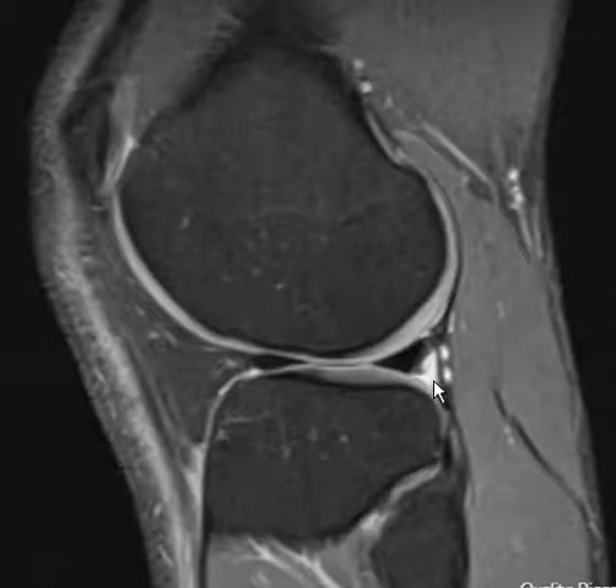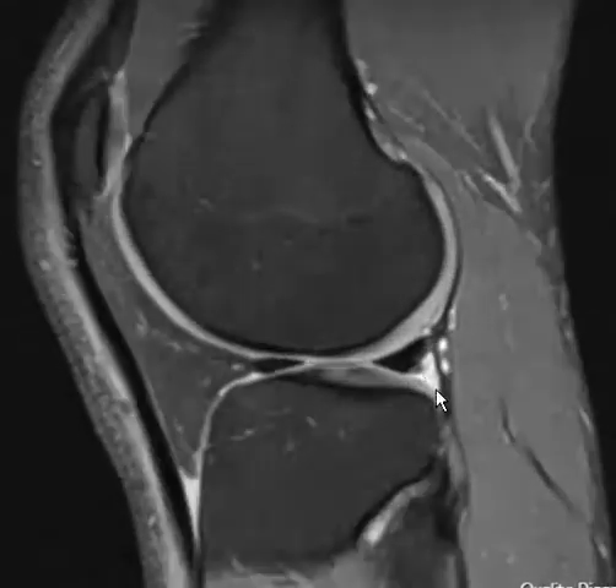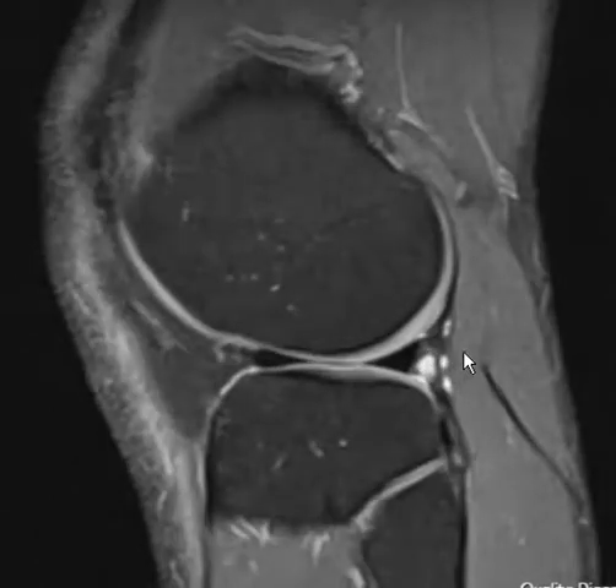If the inferior fascicle tears, the undersurface of the meniscus can drift inward, which may explain why the contour is abnormal here. This is a very soft call and may not be true, but it may explain the funny contour. And that's it — thank you very much.